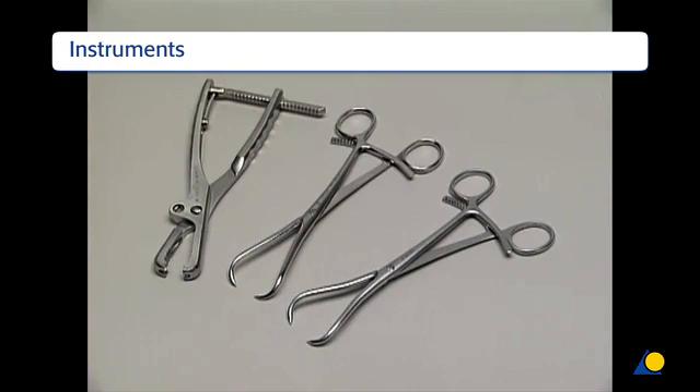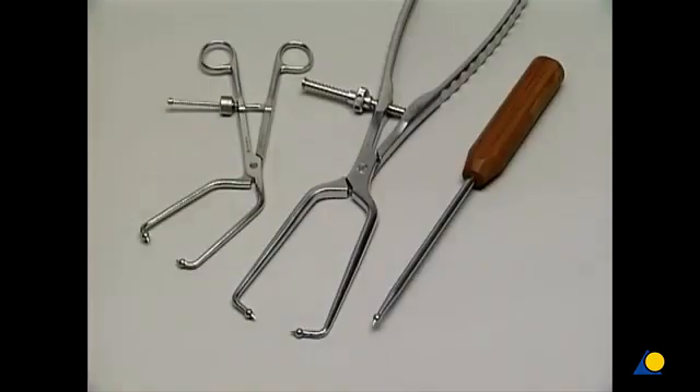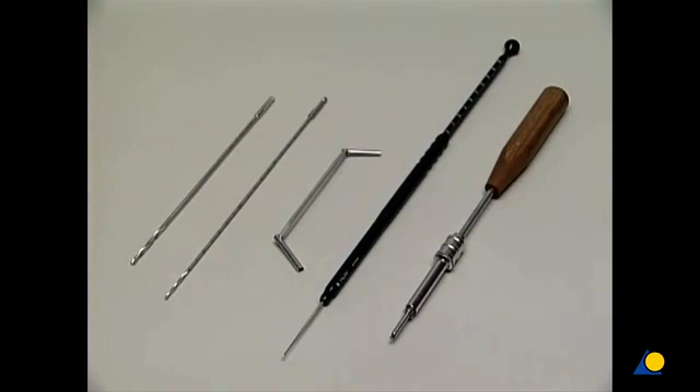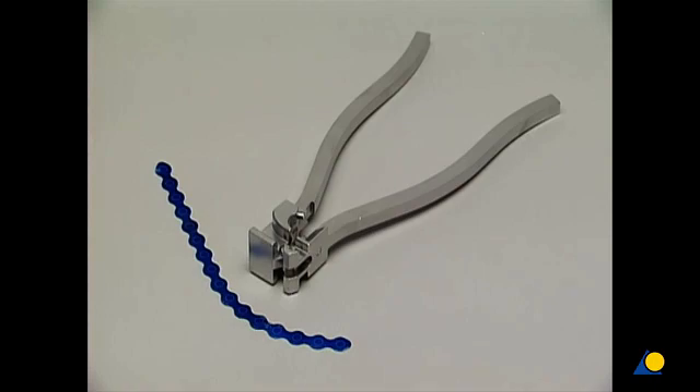The standard instruments for reduction are the Faraboeuf clamp and two-pointed reduction forceps. The special pelvic reduction instruments are the angled reduction forceps, the large reduction forceps, and the ball spike. All of these instruments have a pointed ball tip. These instruments from the basic pelvic instrument set are used to insert the 3.5 mm cortex screws. The bending template and the bending pliers are needed to contour the plate.